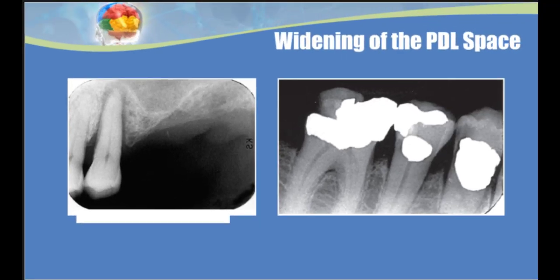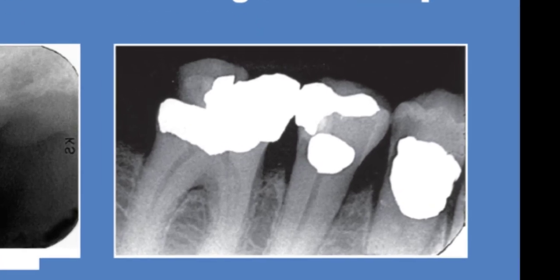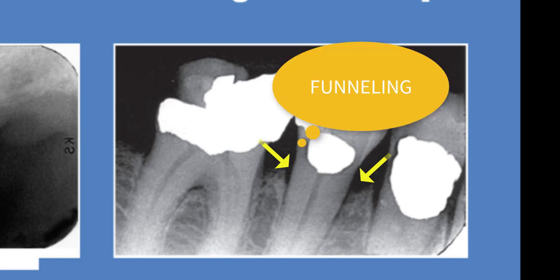In a second picture, we can see widening of the PDL space caused by bone resorption on either the mesial or distal of the intercrestal bone. This is what we call funneling.